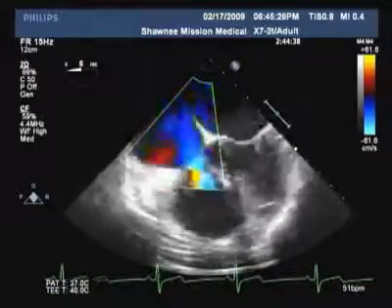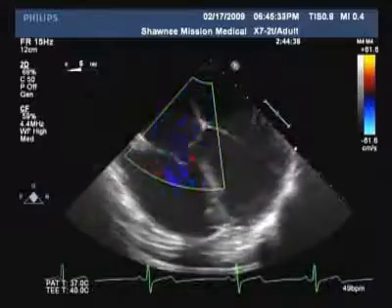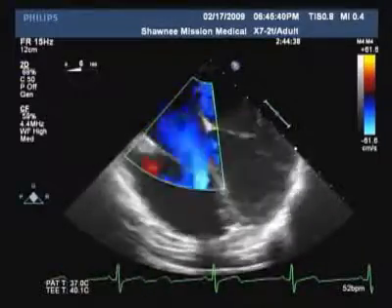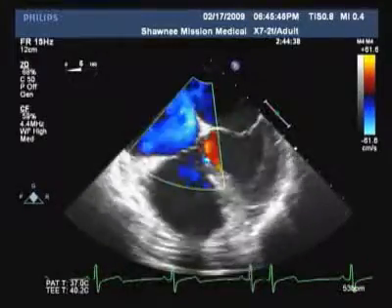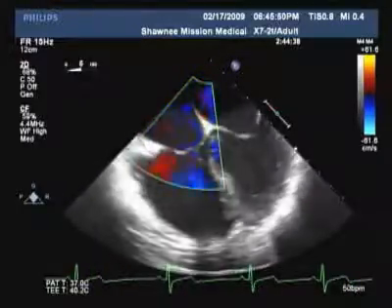And blood flow goes then out through that aortic valve that we saw earlier, has 2 cusps, and that's how you get oxygenated blood flow to the rest of your body. And sometimes we have some little holes in the heart. We do. Especially up there in the atrium. We do. So right now, don't see a lot of tricuspid regurgitation or leakage going back through that tricuspid valve. Right. The structure in the middle up top that divides the left atrium and the right atrium, you'll see it right in the dead center of the screen. Color's kind of going across there.